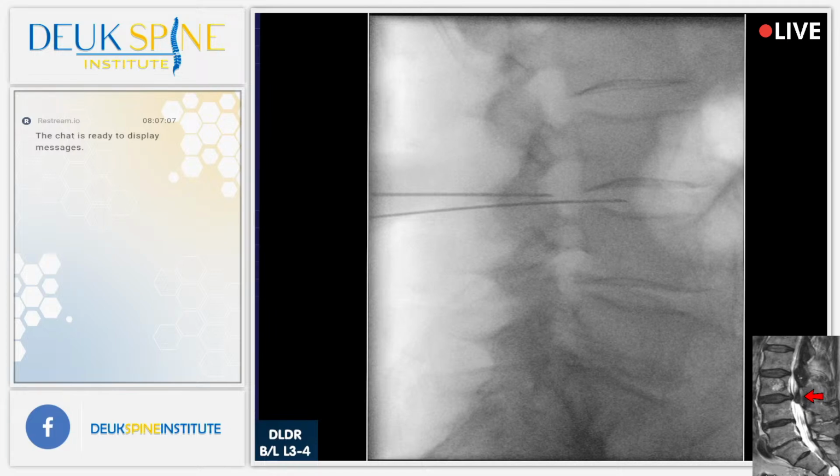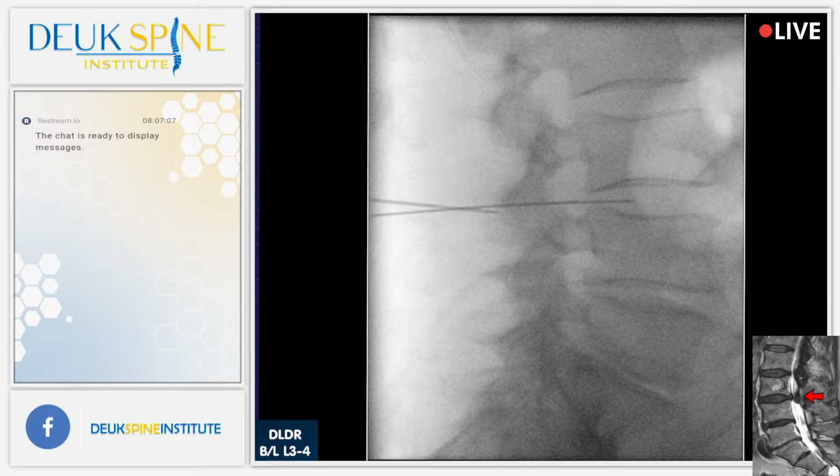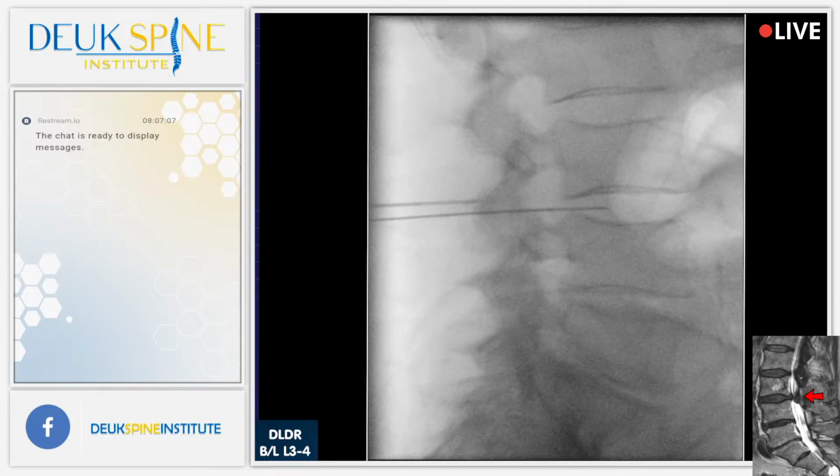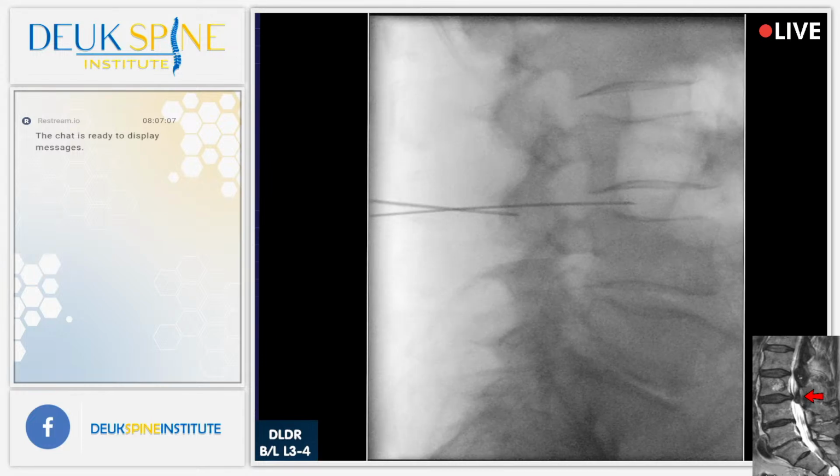All right. Well, we're just gonna have to wait here another minute until he's completely reliable. Yeah, you gotta learn the balance of just sleepy while I numb them up, and then they gotta be reliable at this point. Lay still. So he's wiggling around a little because for him it's a little bit uncomfortable, which is normal.